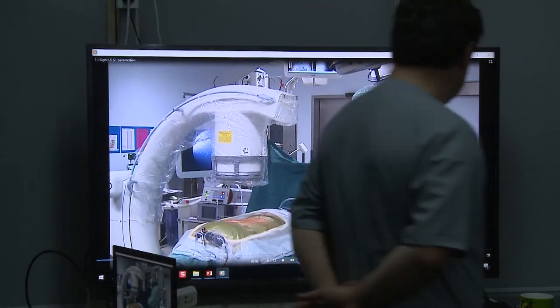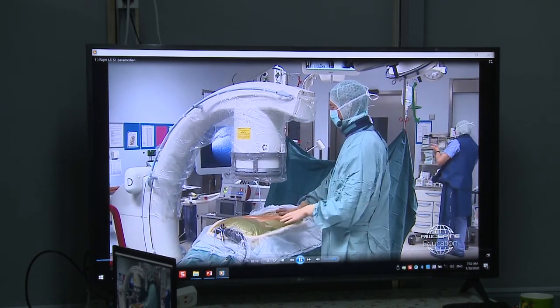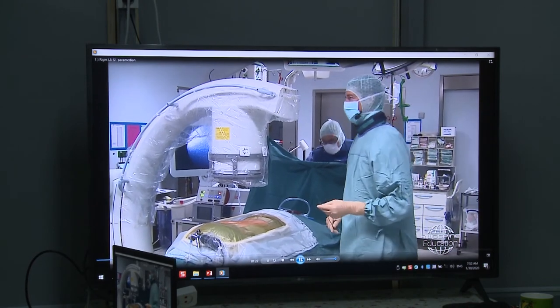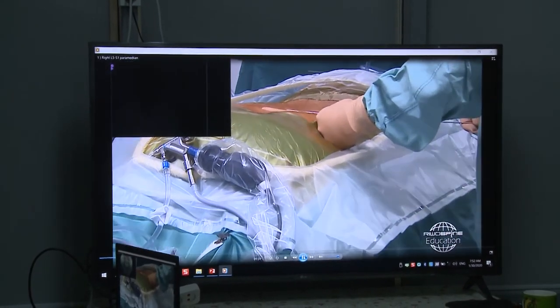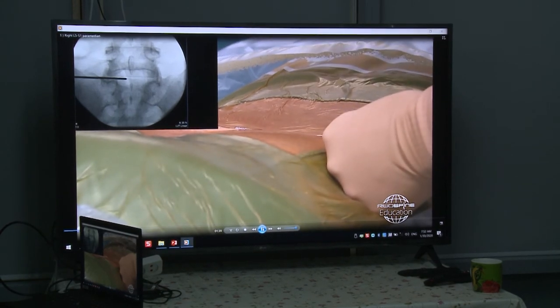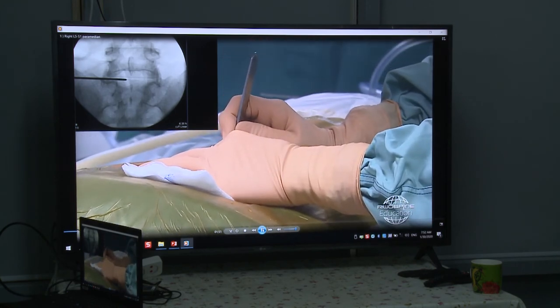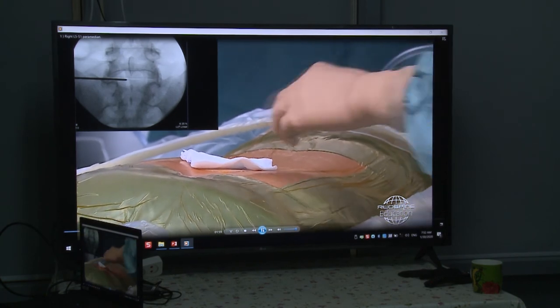For the interlaminar case, we have the patient positioned in prone position with a flat lumbar spine. We're starting with an AP view, and we see already now, in opposite to the standing X-rays, that the interlaminar window looks much better. The skin incision, in this case, is just in the middle of the interlaminar window in craniocaudal direction, but as medial as possible. Be careful not to go between the spinous processes, just a little bit lateral of the spinous process. Then skin incision, and if the patient is not so deep, I like also to cut the fascia. Especially in thin patients, don't go too deep, because you can cut the flavum ligament immediately.